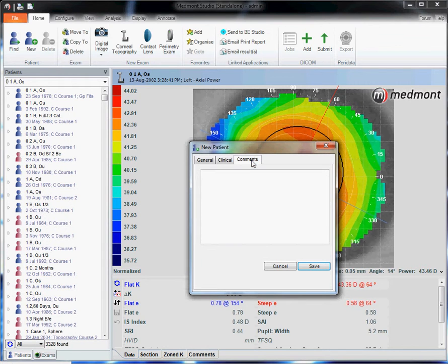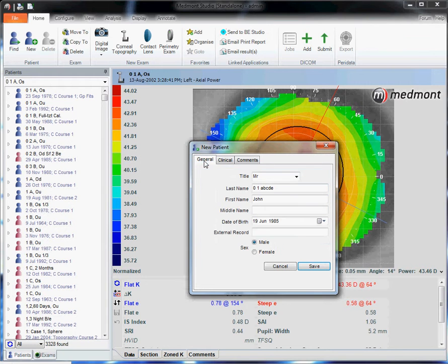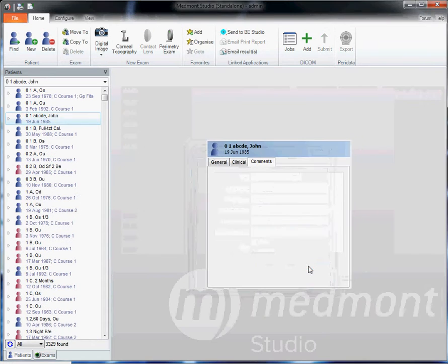Under comments, you can enter in any information specific to this particular patient. Then once you're satisfied, you can click Save.